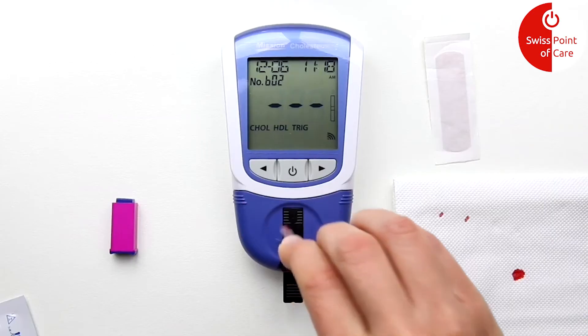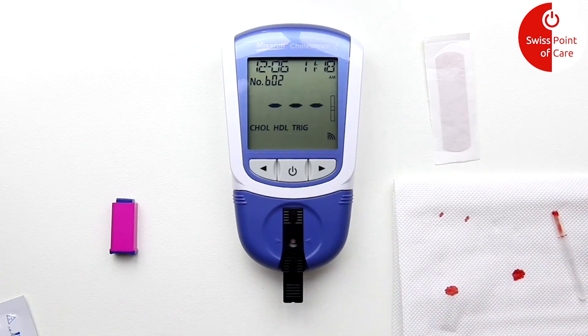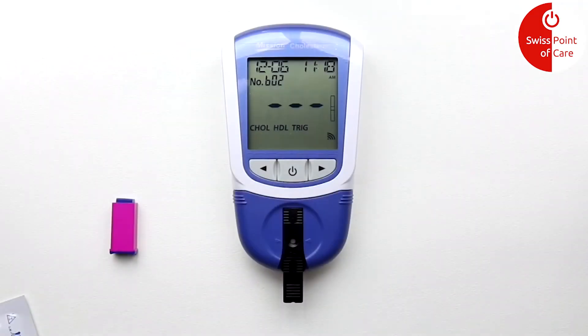You will see three blinking lines, which means that the test is currently running. Within one or two minutes you will see the results. Use the arrow keys to view the results.